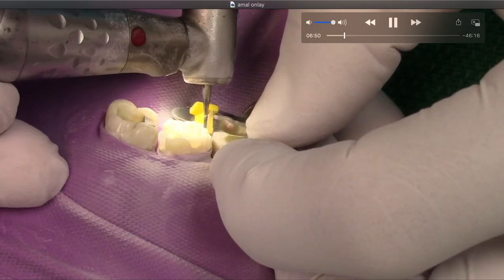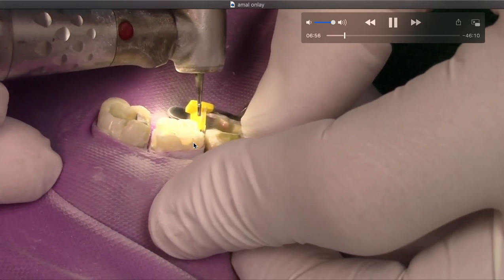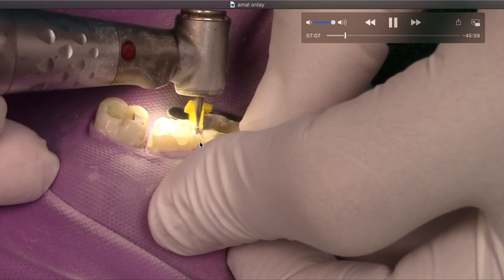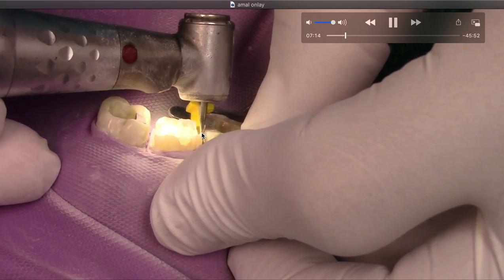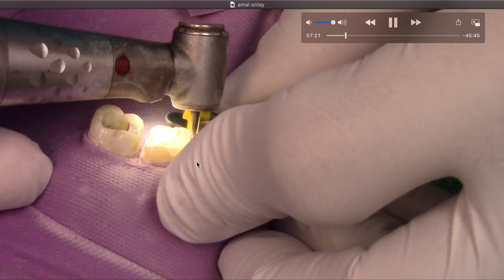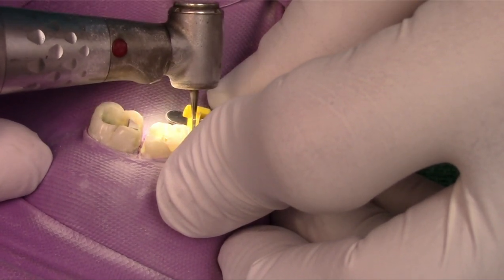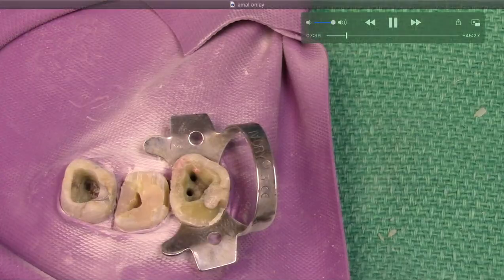We'll take out that wedge and add it to the distal part. What I'm going to do is break the contact — we're literally making a 0.8 millimeter width of preparation. If you're worried about removing tooth structure, think that your zirconia or full porcelain crown is going to remove one millimeter anyway. It's really critical to break that contact so you can get your band all the way down and provide that resistance form for your amalgam when you go to carve it.